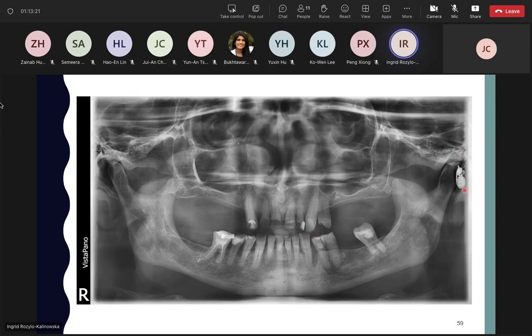Now, this is hearing aids, and if we ask the patient to remove it for the scan, of course, we will not be able to communicate with the patient very clearly. And in this case, this hearing aid overlaps a little bit the TMJ left condyle. But on the other hand, we must remember that TMJ radiographs in panoramic radiographs are not the best for evaluation of TMJ. So if a part of a TMJ is obscured, it doesn't really matter.